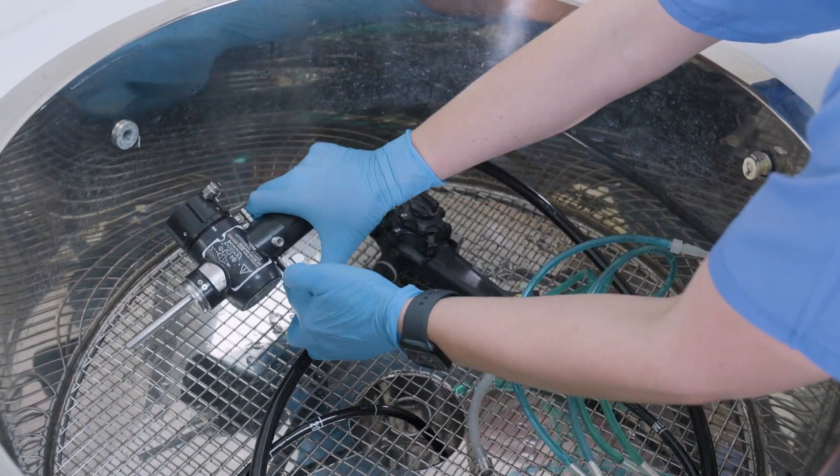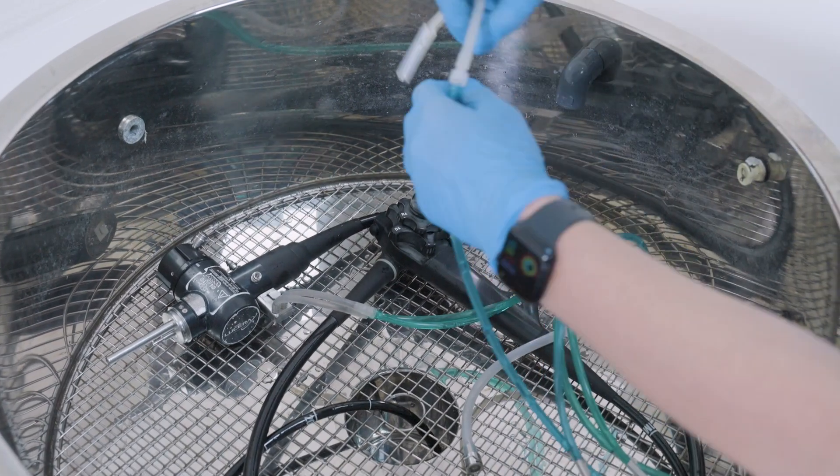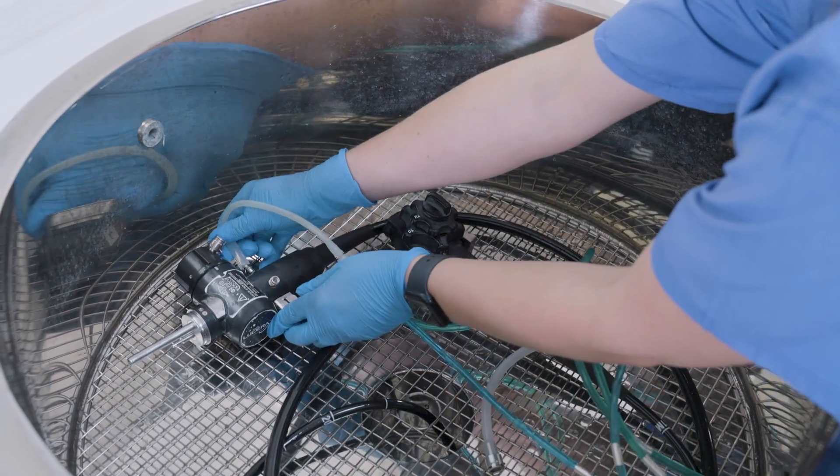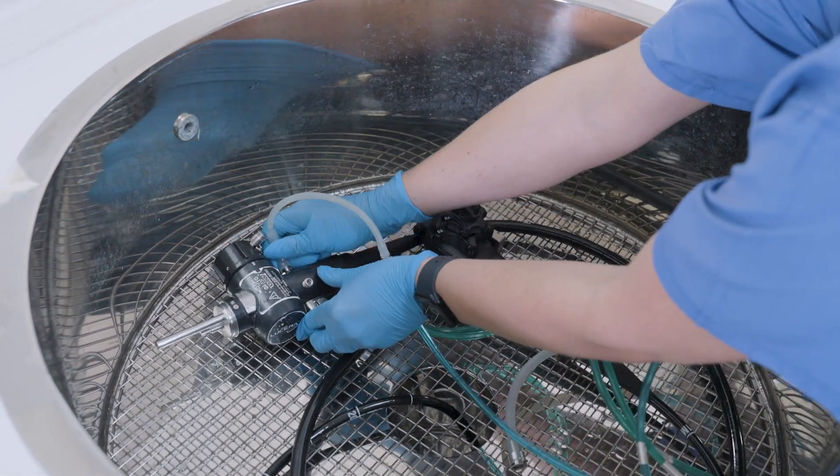The reason the tip of the endoscope needs to sit within the canister of the chamber is so that the tip of the endoscope also gets a clean using the nanoparticles of hydrogen peroxide.